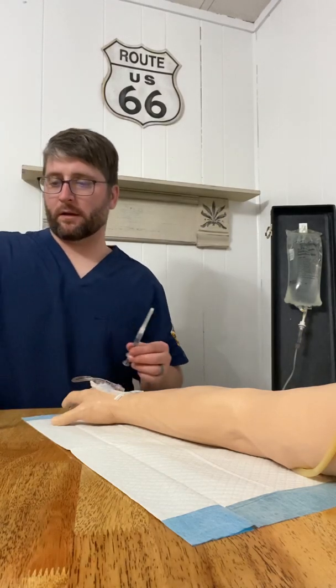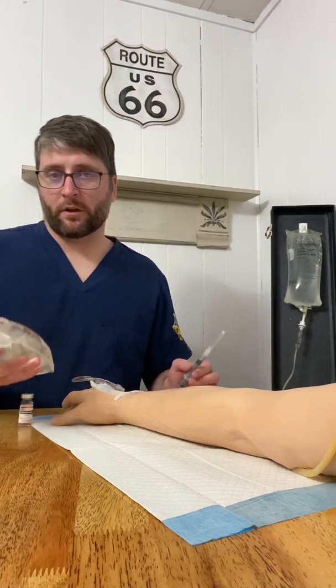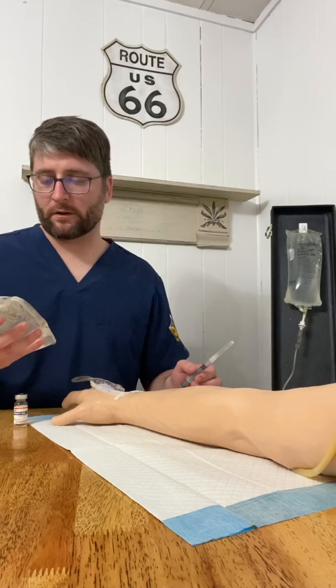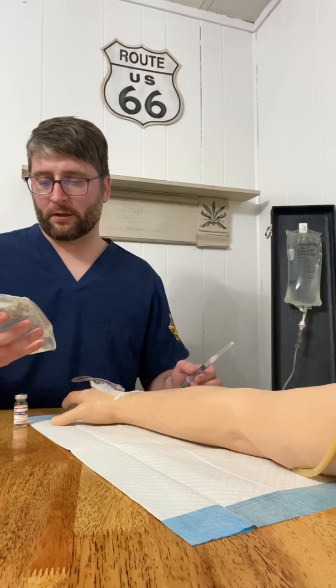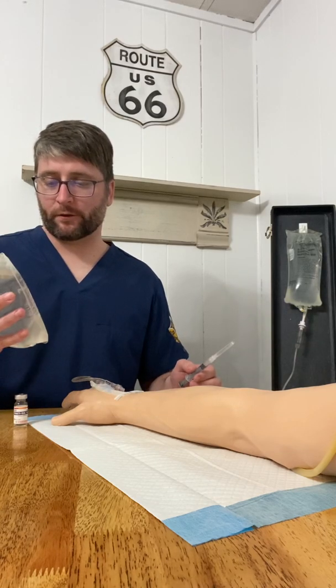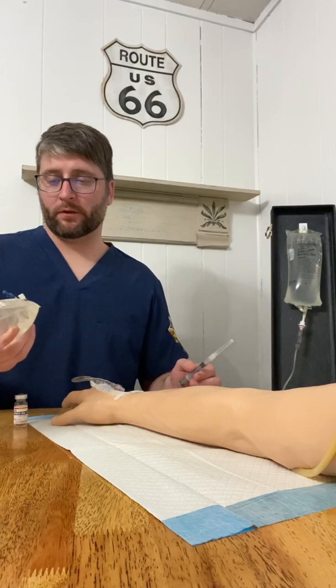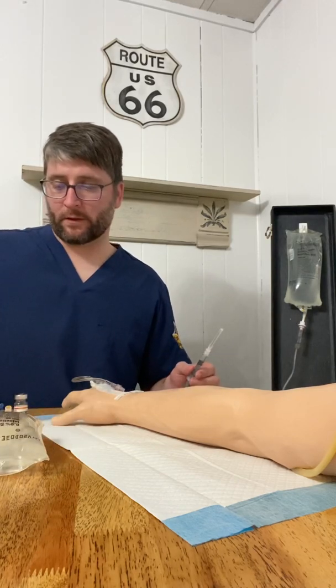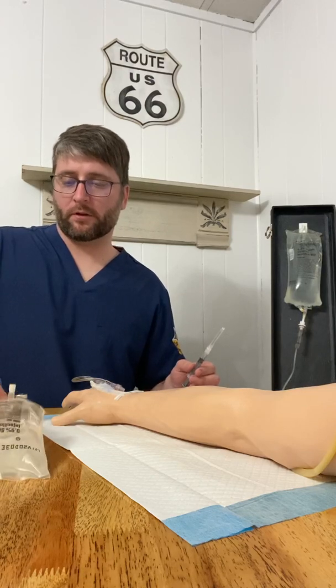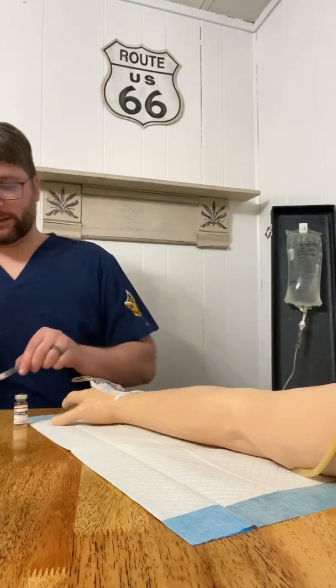Now we're going to ensure that our IV bag is correct and not expired, not cloudy, and has no particulates floating around in it. And now we are going to alcohol swab our port there, and now we're going to use aseptic technique.